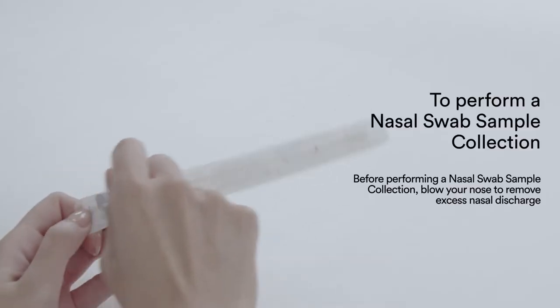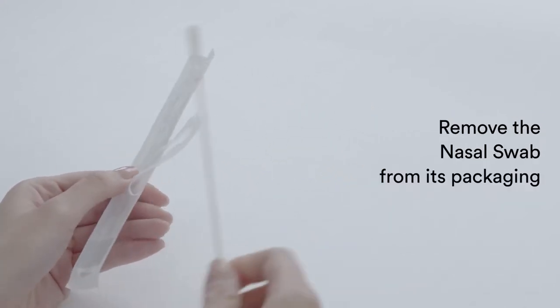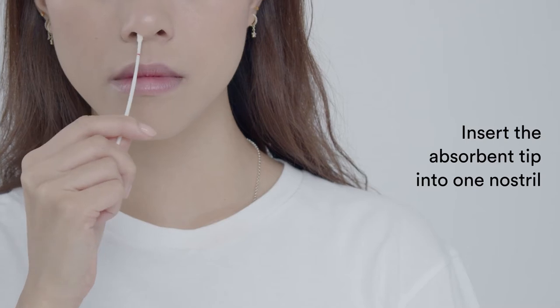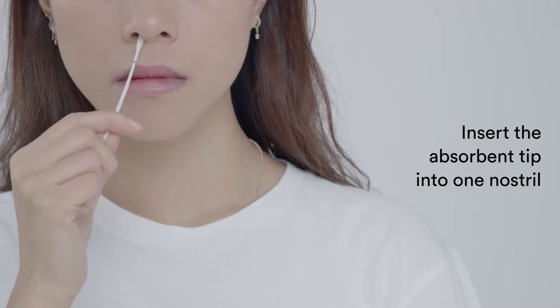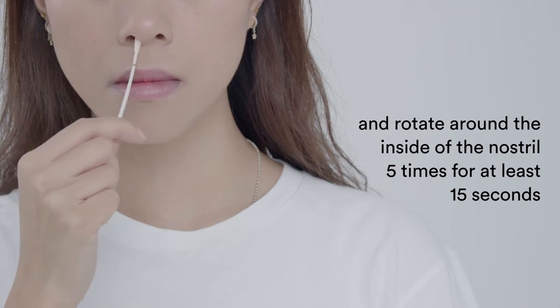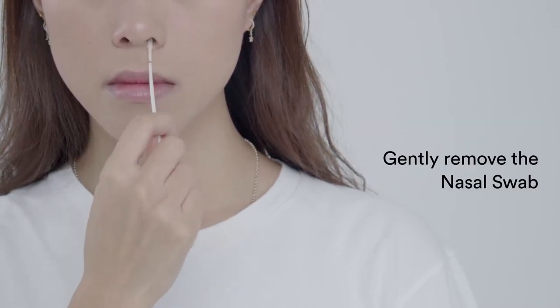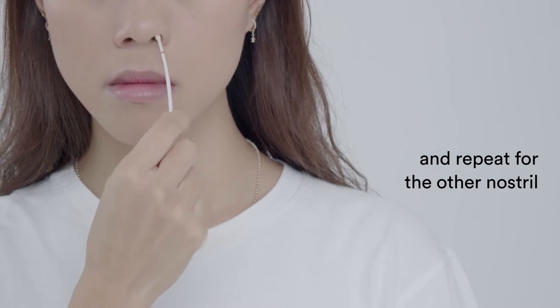To perform a nasal swab sample collection, remove the nasal swab from its packaging. Insert the absorbent tip into one nostril and rotate around the inside of the nostril five times for at least 15 seconds. Gently remove the nasal swab and repeat for the other nostril.